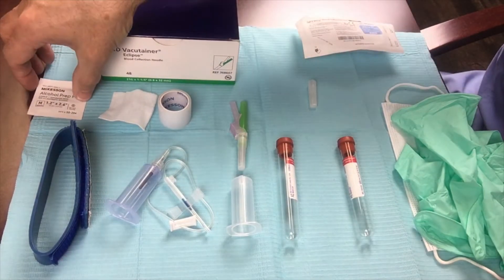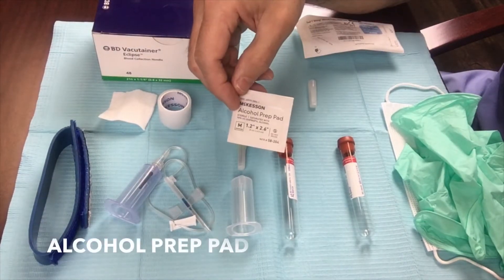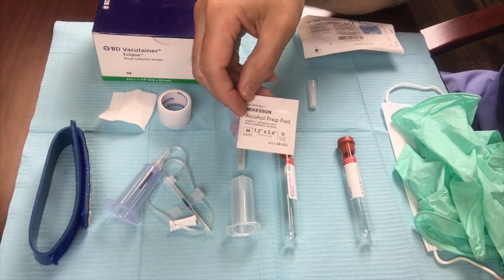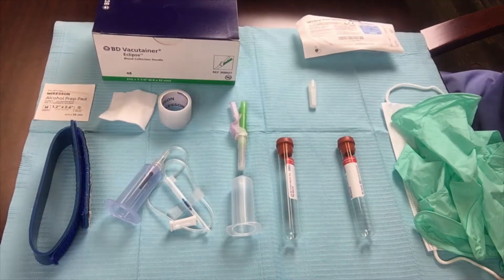The next thing would be an alcohol prep pad. I use this to prep the skin in the area of the vein which I'm going to perform the blood draw on. You can either let that air dry, or sometimes you can use a gauze to dry the skin after you've done that.